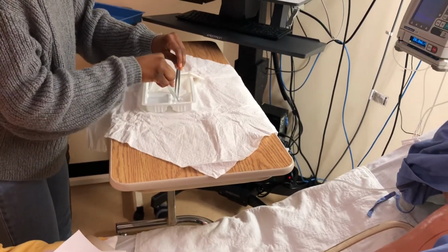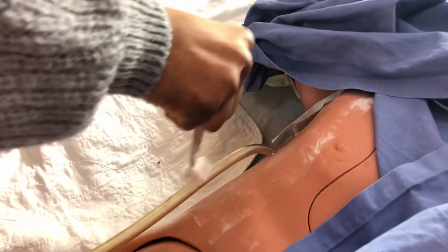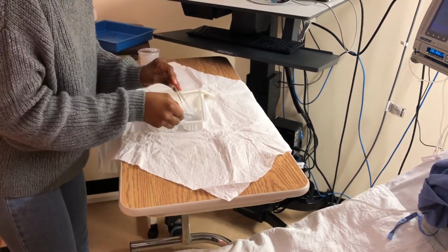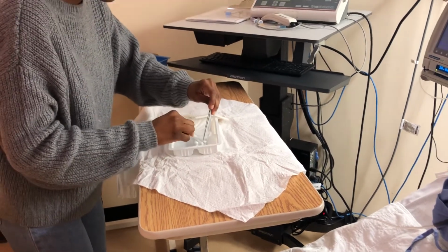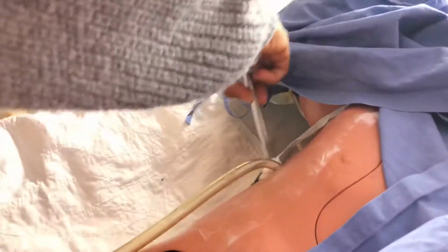So make our rosette. Gonna clean the tube, one swipe and it's dirty. So now I will dry. Swipe. Make the rosette again. We'll use a bigger one. One swipe around, dirty.